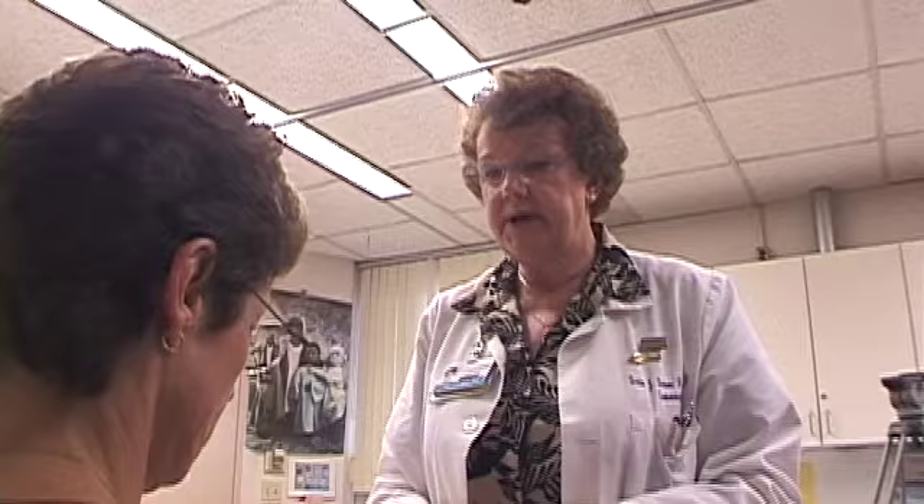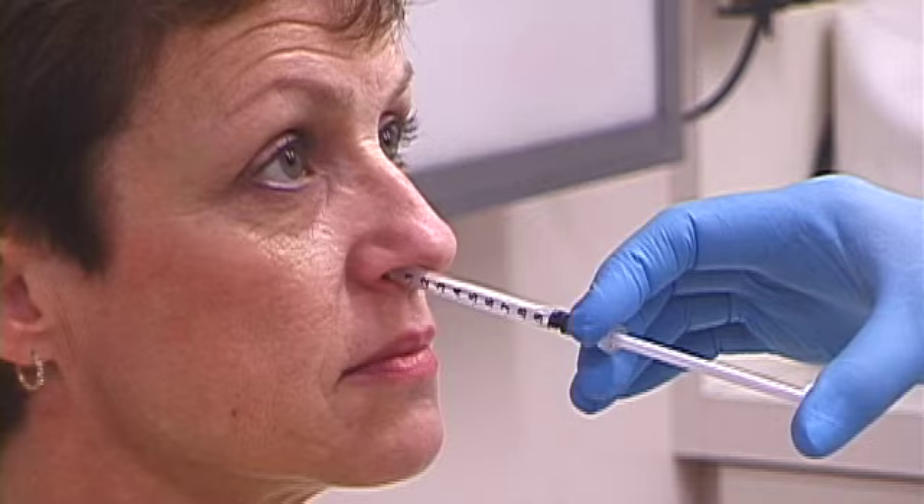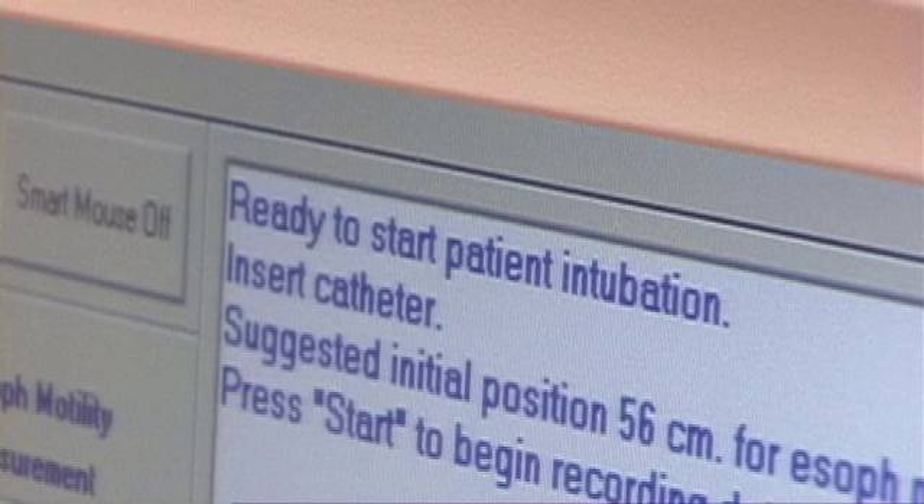The patient is instructed to put their chin on their chest during insertion. A cup of water is provided, as small sips may help with insertion of the device. After putting on the appropriate protective clothing, a topical anesthetic is drawn and administered by syringe into one nostril, and the throat is also numbed in preparation for the study.